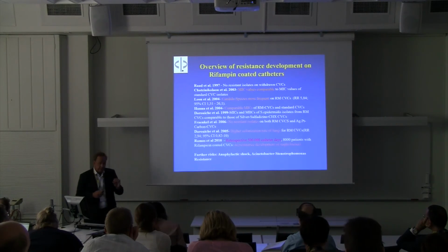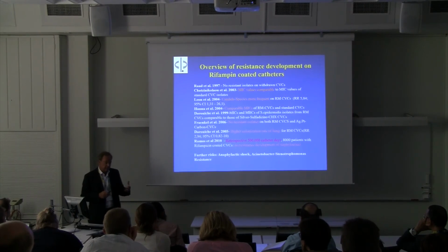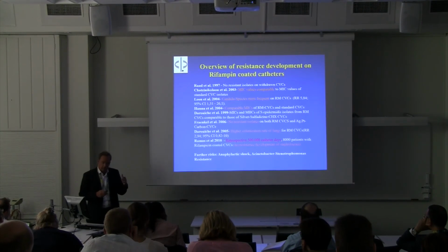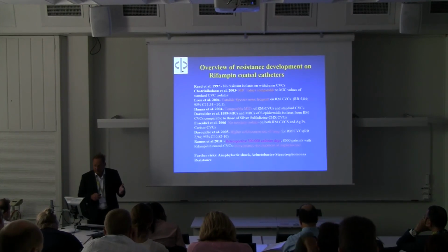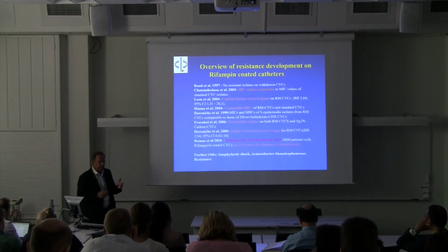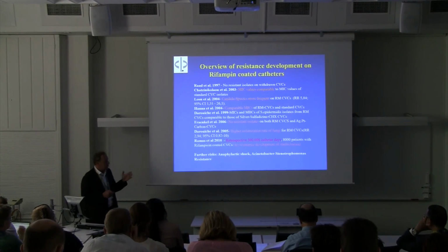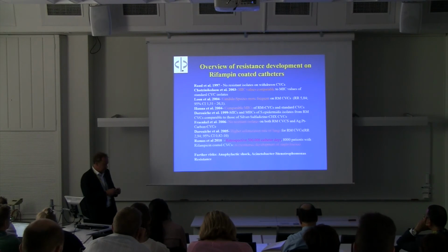Be cautious, but up to date, the authors did not find any hint. You have to keep in mind that an antimicrobial device is not inducing any systemic level of drugs. You only have a local level of drugs, because only micrograms are released compared to grams of antibiotics applied systemically. No systemic application of the drug, only local, and luckily, up to date, no hint for any resistance development.